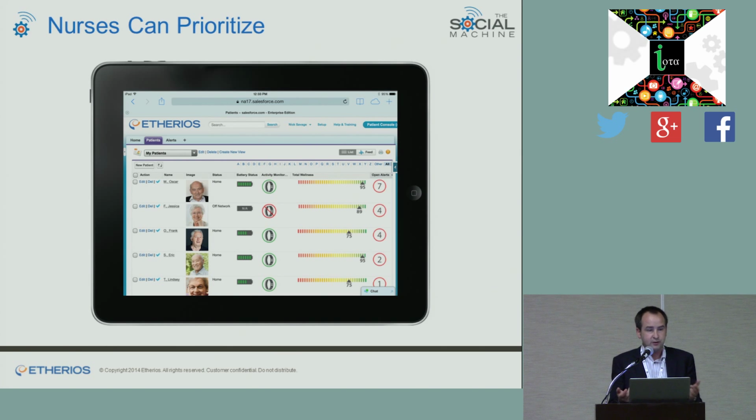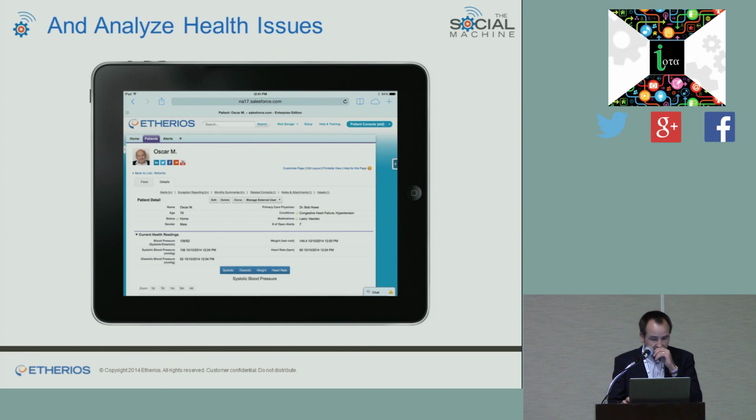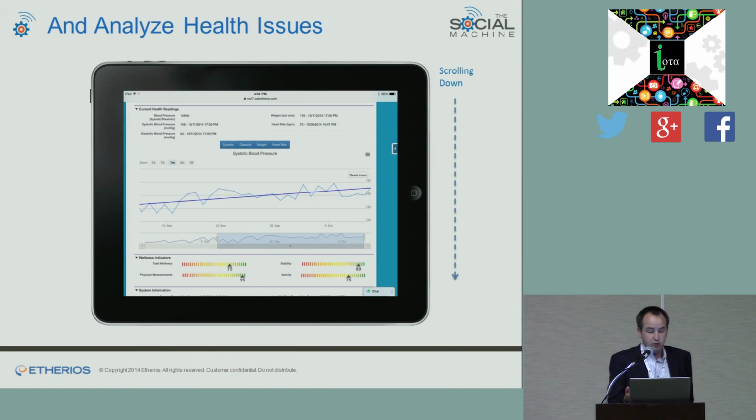But we see at the top here, Oscar's had 7 alerts in the last week, and so that's someone I really want to dig into and find out why that's happening. When Oscar's taking that information at home, you have immediate access. It might be kind of small, but you have immediate access to what those readings were. And I think more importantly is what those look like over time. In this case, we're talking about a trending line on his systolic blood pressure.